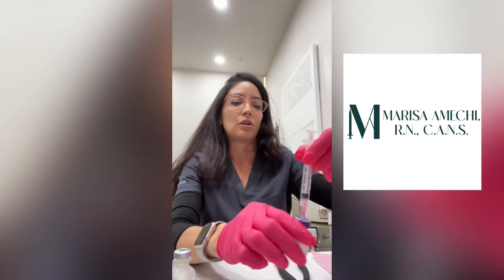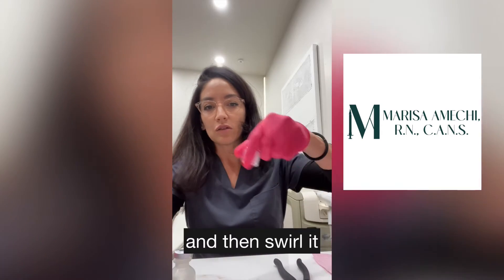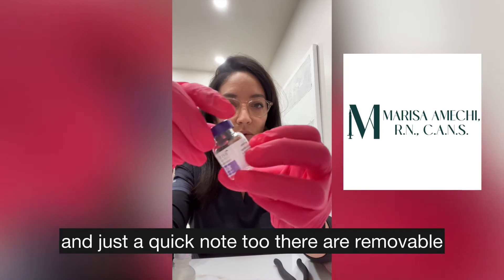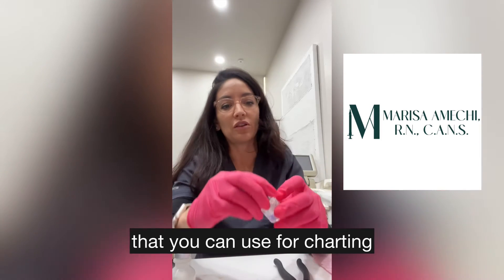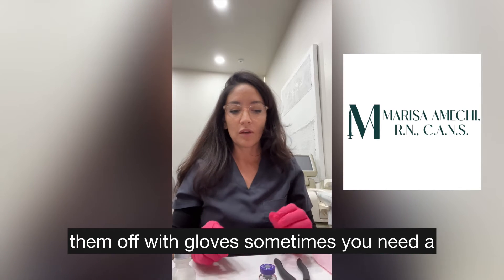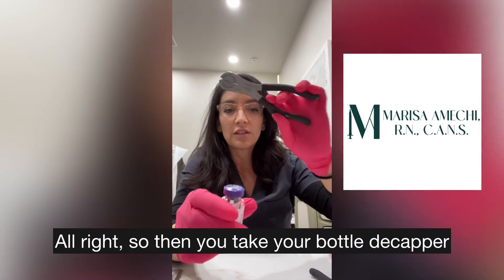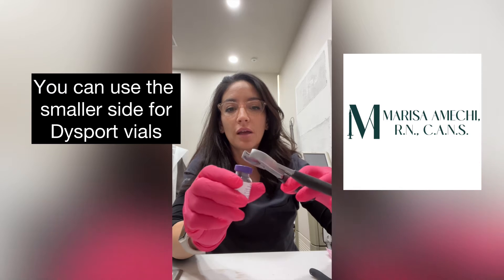Then you discard your 3cc 18-gauge needle and swirl the vial. A quick note: there are removable stickers on the side of the Botox vials that you can use for charting. They come off — it's sometimes hard to take them off with gloves, you may need a sharp fingernail.